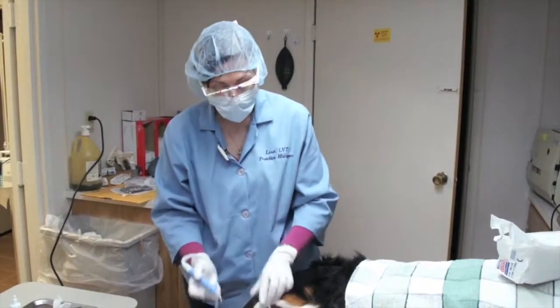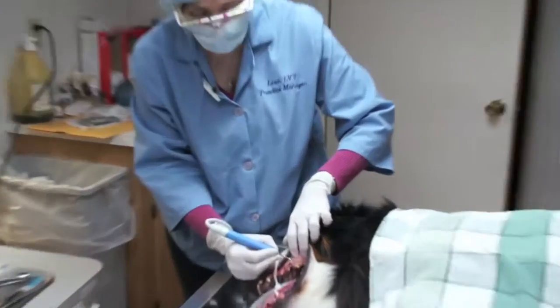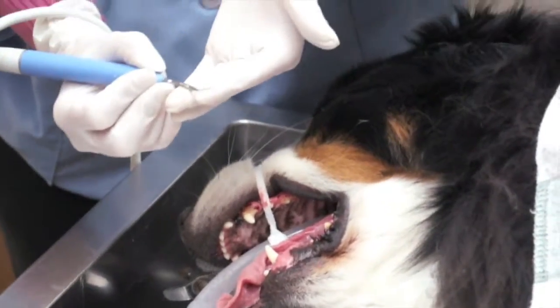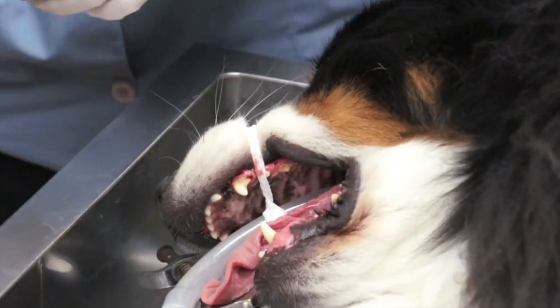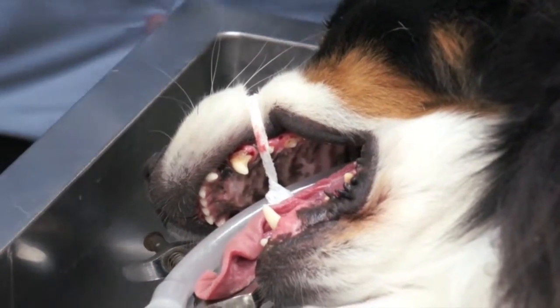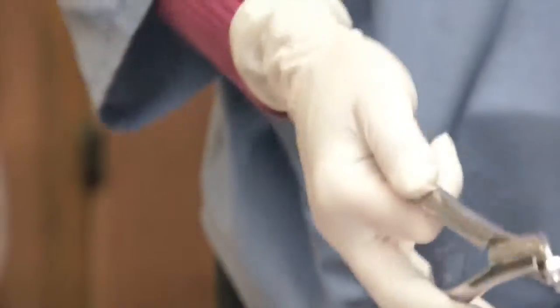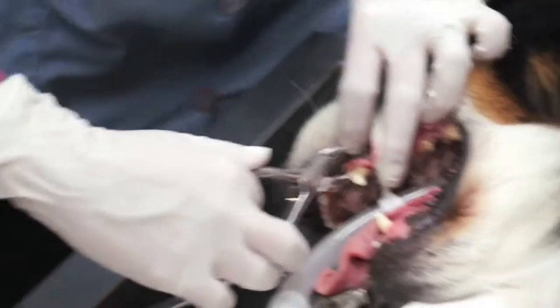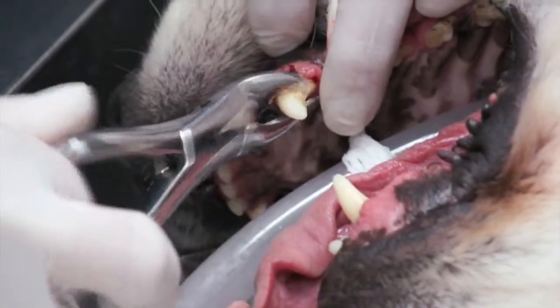Before I even get started, I would normally just like to start by cleaning the teeth, but when I have large amounts of plaque and tartar on the teeth, I can end up wearing down the head of my scaler, so you never want to start by scaling right with your scaler. An instrument that you would want to use, and it's one that is common to use during a dentistry, is called an extractor. An extractor does several things. One, it extracts teeth, but what it also does is it breaks the tartar off of teeth so you don't dull the head of your scaler. As you see, it breaks it right off.